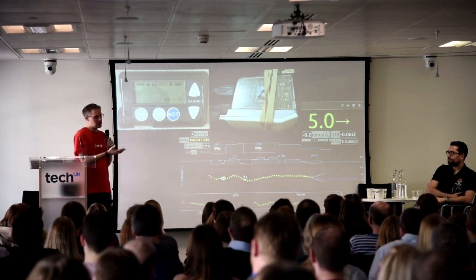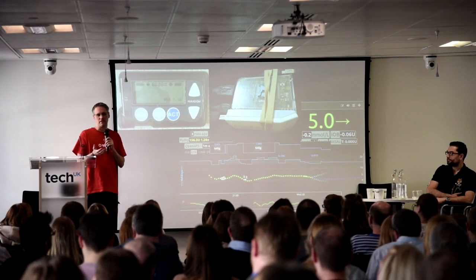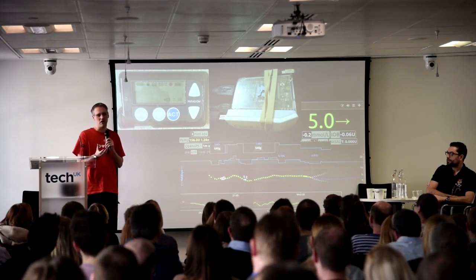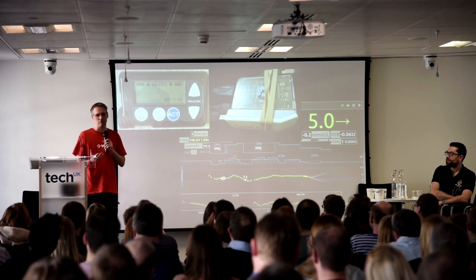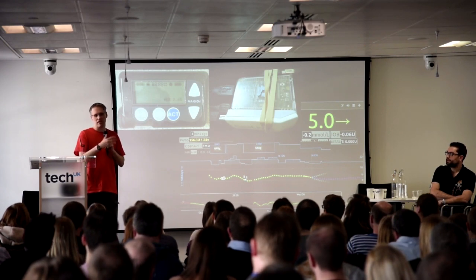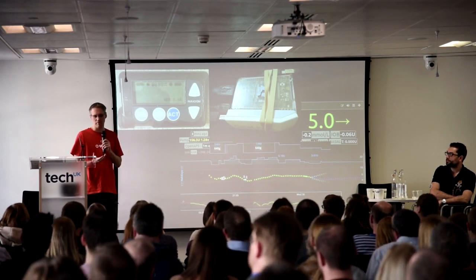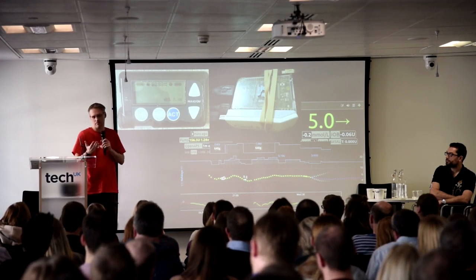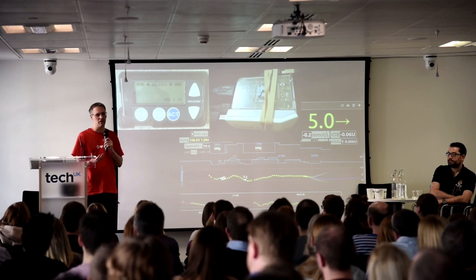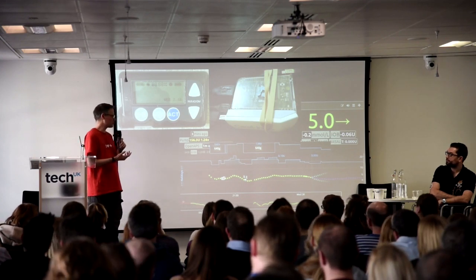But as Dana's shown already, OpenAPS at its heart is 270 lines of code. I don't want to belittle what it's doing in terms of taking control of basal on your pump, but it is inherently safe in doing that, in my opinion. That's just my personal opinion and the decision that I've come to for my daughter.